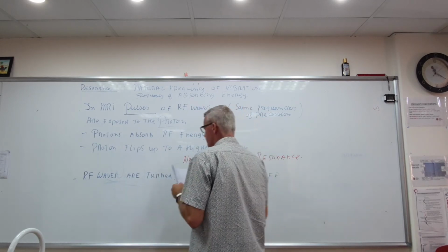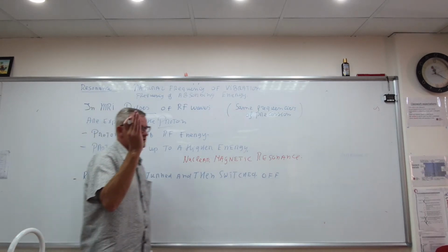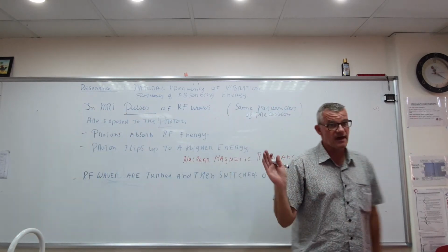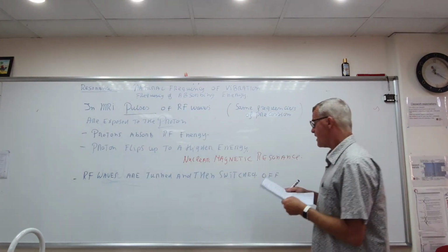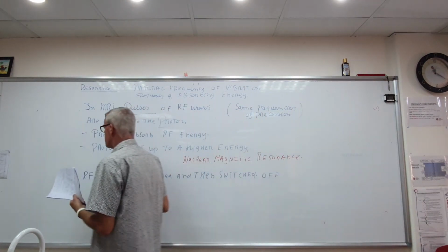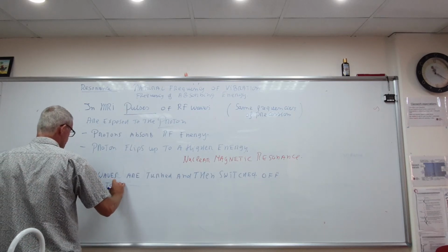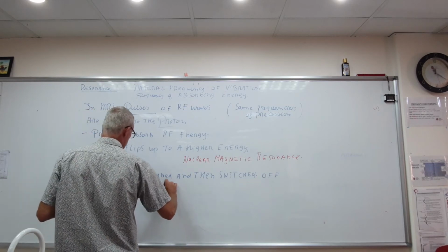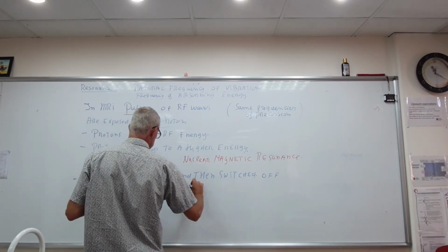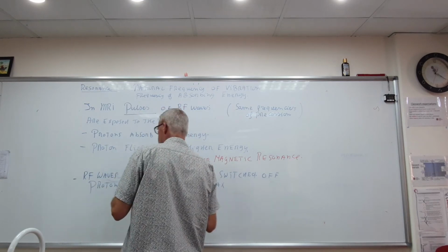Now what's going to happen when you switch off? That means the protons go back to their original state. And they will gradually relax. Okay?